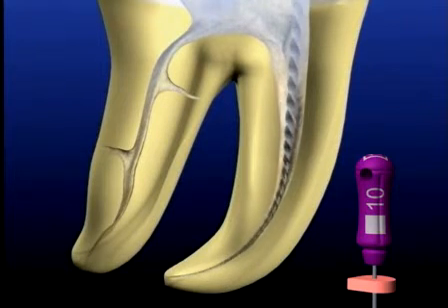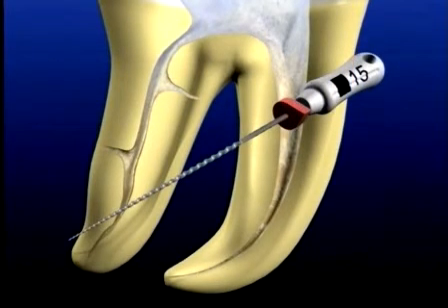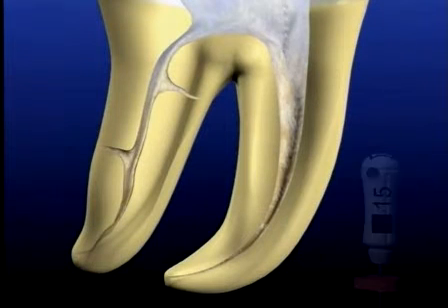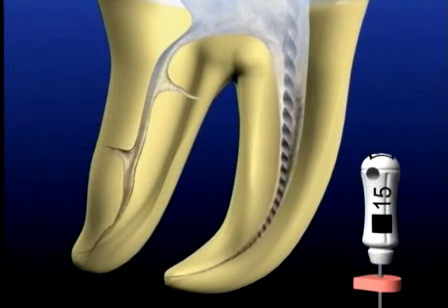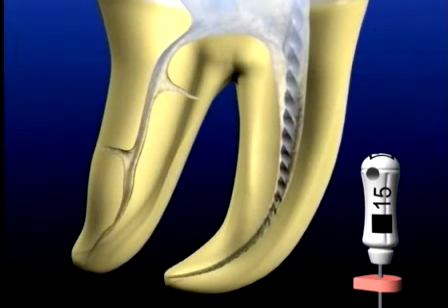By taking the tin file 1 millimeter through the foramen, we've transitioned the foramen to at least a 12. Recall that the 15 file is 50% bigger at D0 than the 10. The pre-curved 15 file is inserted and gently worked to length. If necessary, we can use chelators to encourage the mechanical objectives.